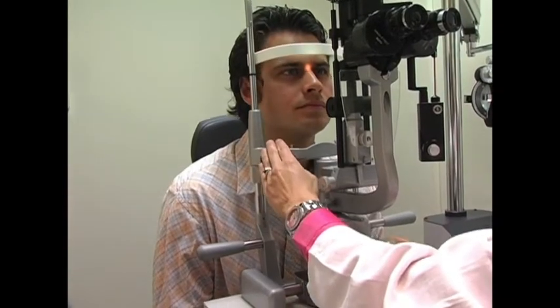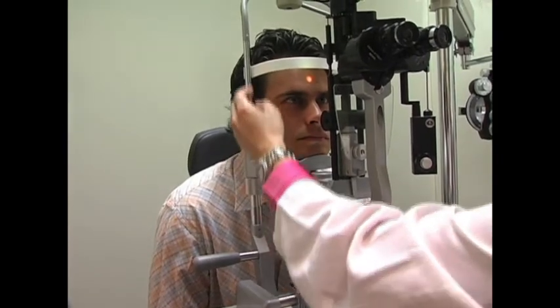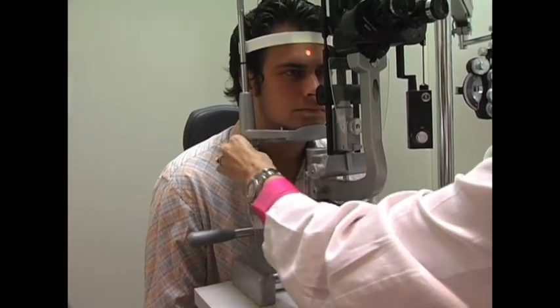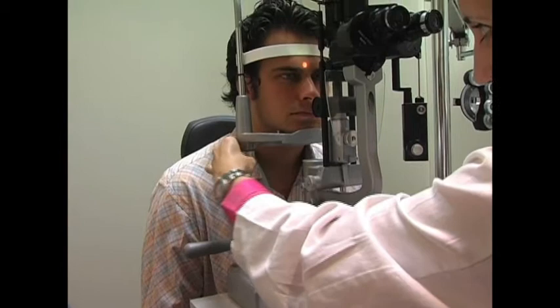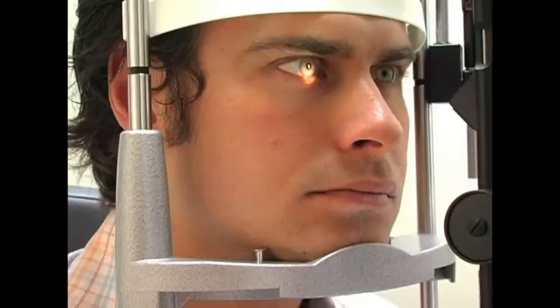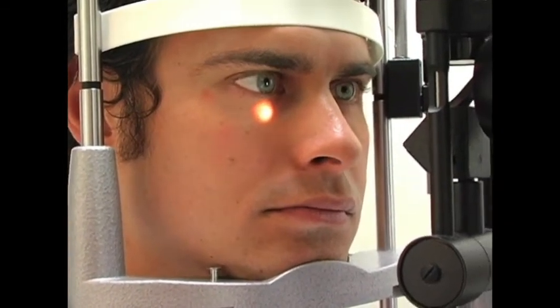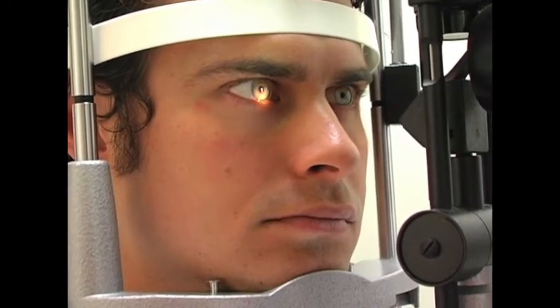To begin, the patient should be properly positioned. Ask the patient to lean forward, placing their chin on the chin rest and their forehead on the bar across the top. Move the chin rest up or down using the dial until the patient's lateral canthus is lined up with the black horizontal mark on the side of the slit lamp. If your slit lamp does not have a mark to indicate the proper positioning of the chin rest, simply raise or lower the chin rest until the light source is able to illuminate the entire eye.